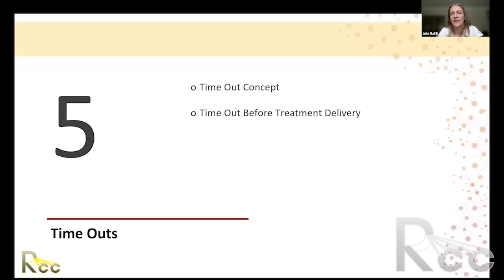So if the physician is noting changes to the tumor presentation during treatment, they may want to go back and acquire a new simulation for planning to make sure we're including all of the GTV, CTV and PTV that they want for treatment. But the plan is based on their simulation image, and so we want to set up to that image as our reference unless we're adjusting the plan and making a change. And then we would have a new reference image.